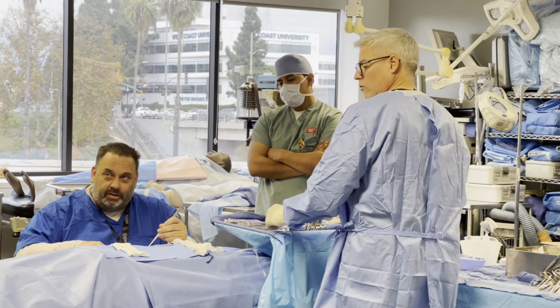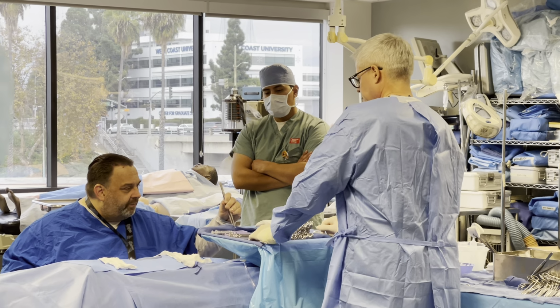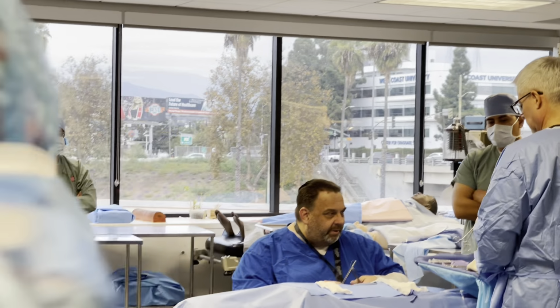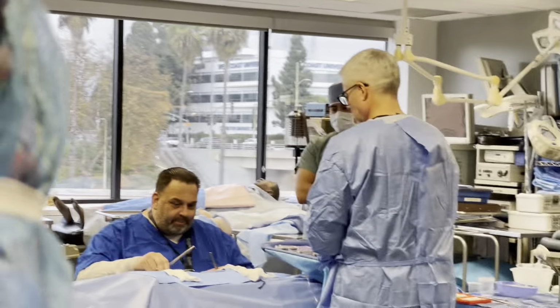Okay. But every time we count, we always go field to Mayo stand to back table. Anything on the field will be counted by the circulator afterwards, okay? So if we're doing, say, we got all the regular stuff, and we're on Kelly's next, right? I'll say Kelly's. Kelly, we got 1, 2 on the field.